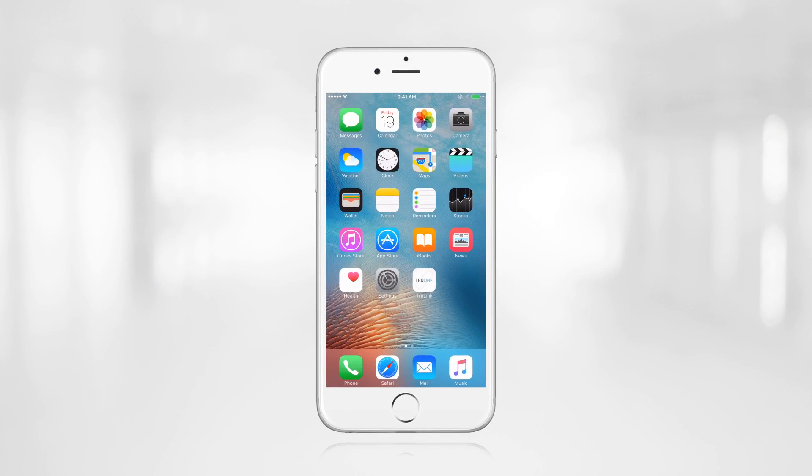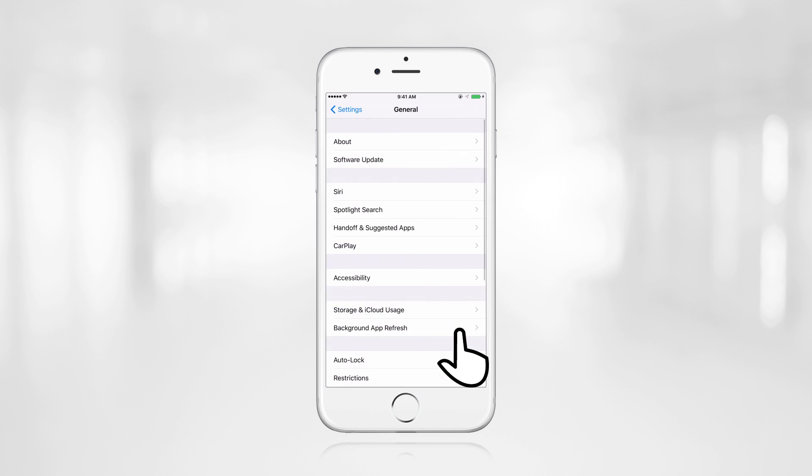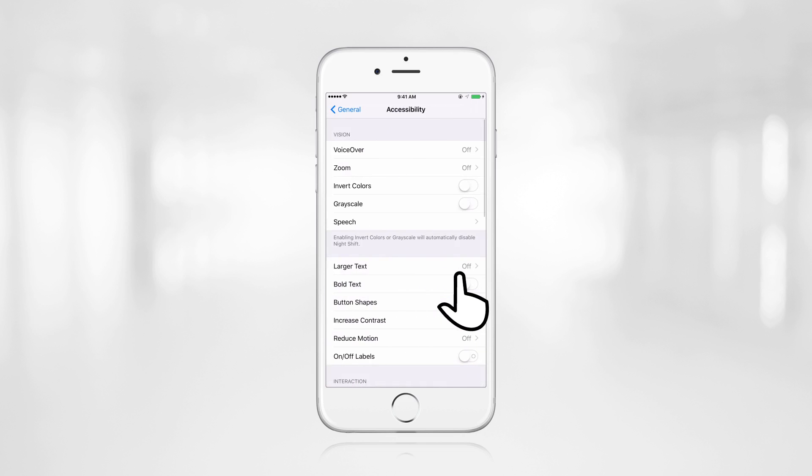To pair the Halo hearing aids to the patient's iPhone, click on the Settings app. Then find and click on the General tab. From here, select the Accessibility menu, scroll down, and select Hearing Aids.